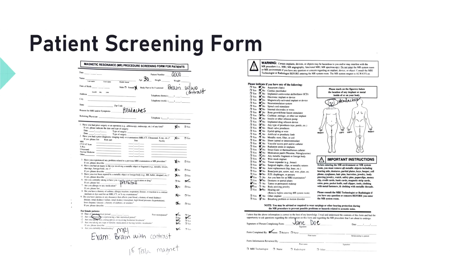Here we can see the original screening form completed by Ms. Jane Doe. During the initial review, we can see that she's currently pregnant and taking prenatal vitamins, and has several metabolic and physiological factors that require her attention as an MRI tech before she enters the magnet room, such as tattoos or permanent makeup and body piercing jewelry.